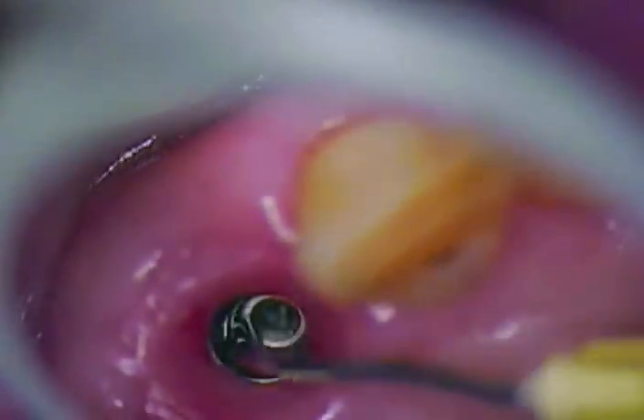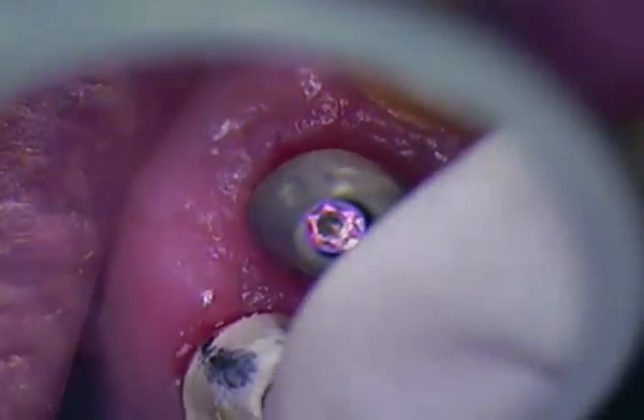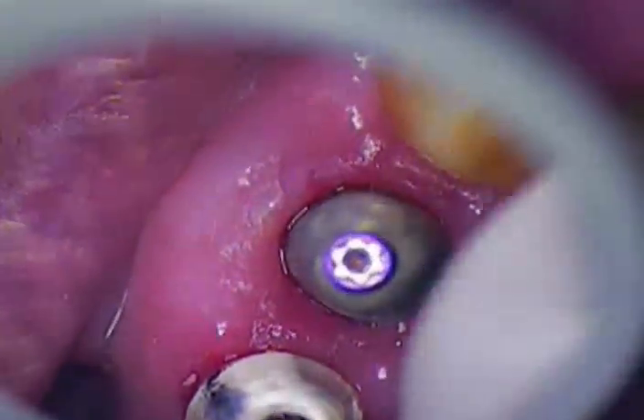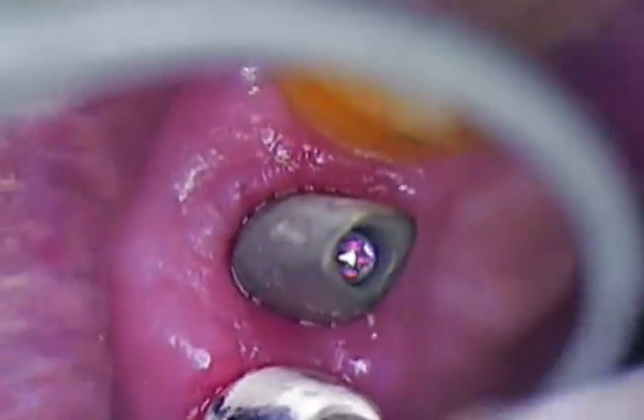I'm just making sure we're meticulous internally and suctioning all the way down. Now we'll just gently slide in our first abutment. These are all made by hand. Let's get the first one in there and get that lined up. We'll tighten it down by hand.